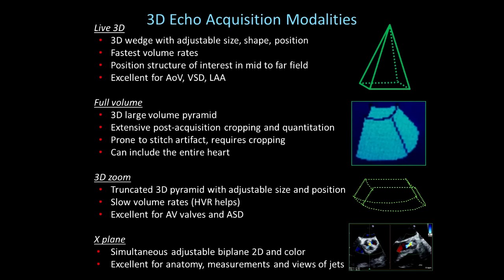The second commonly used 3D echo acquisition modality is 3D full volume. This involves a large volumetric pyramid of 3D data. It requires extensive post-acquisition cropping and quantitation. It's prone to stitch artifact, and we will talk about ways to mitigate that and optimize the cropping. Full volume can be used to include the entire heart structures, excluding some great vessels.